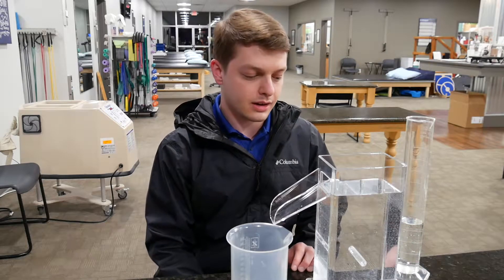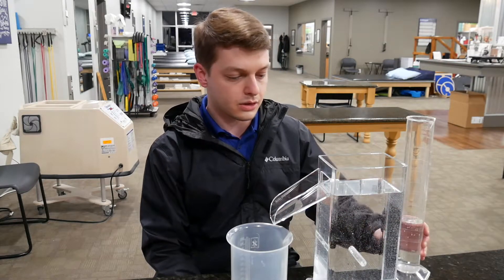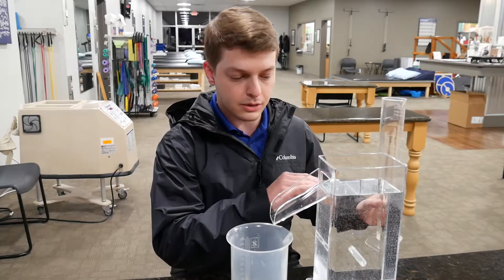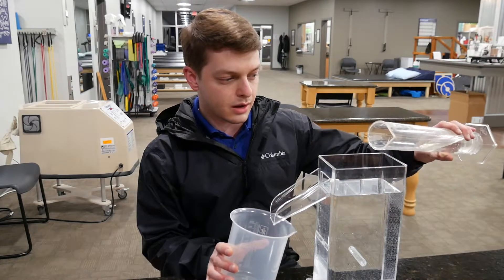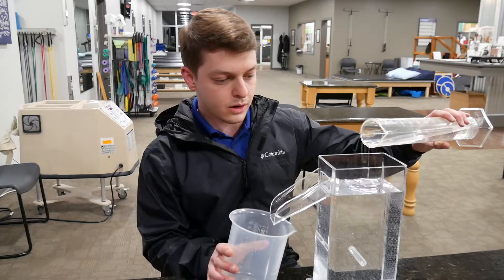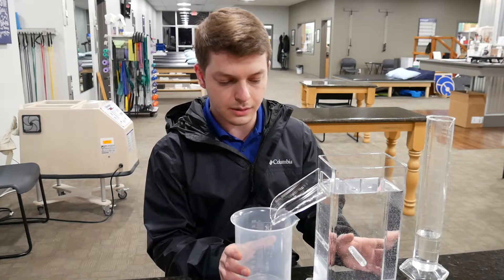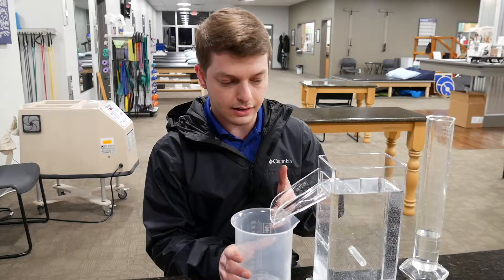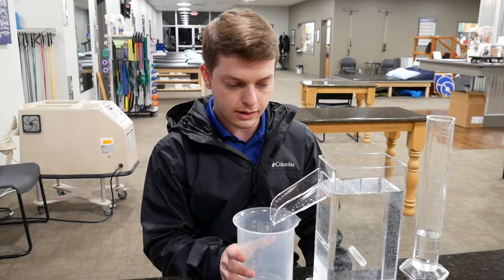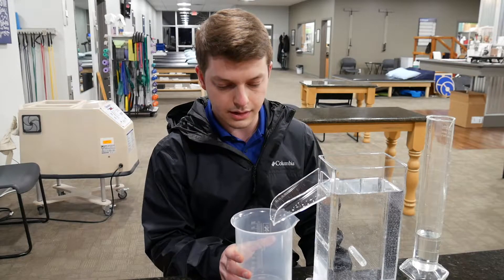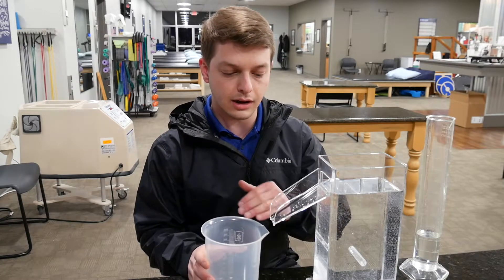Okay guys, so we're going to cover a few points today and the first of those is how to set this all up - how to fill the volumeter. So you see that I already have the water most of the way to the top here. What you want to do is have your beaker here, and what I usually do is pour water until it starts to run out to the side. Let it continue to run out until the stream stops, and you can see the water has stopped coming out there. Then you'll take the water that's in the beaker, pour it out, and dry the beaker out before you measure.